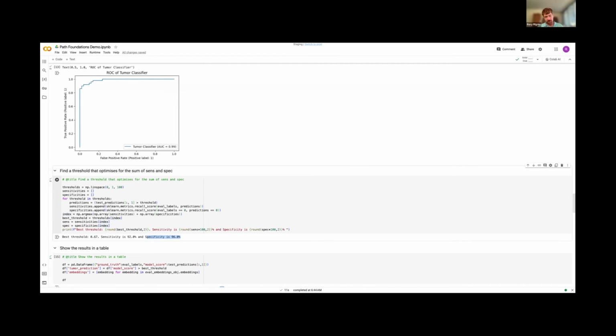And then when you run them, you actually run all, let's say, six models in concert. And you say, which is the highest score? That's the one that I think it is. So that's the way you do that. Now, there's other ways to do that in machine learning. You can have what's called a multi-head prediction, where you sort of feed it multiple heads. We tend to like to binarize things, but obviously that's just a decision you get to make. But in terms of that, we'd probably just do that and then present it as you get a different answer. So it's not just a binary, but under the hood actually it's binaries, and we just take the maximum score.